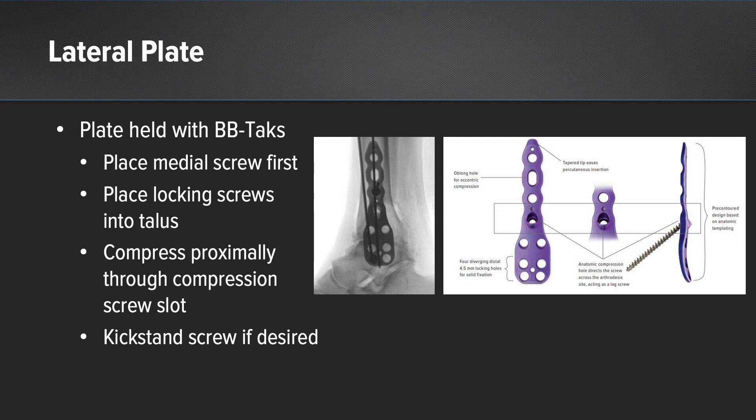I confirmed that the plate is not impinging on the subtalar joint and then I place that medial screw first. Then a few locking screws are placed into the talus and then I compress proximally through the compression screw slot. At this point you can then place the kickstand screw if you desire.